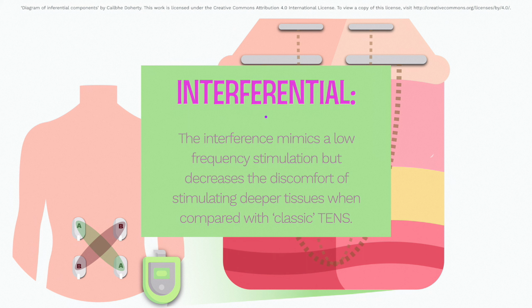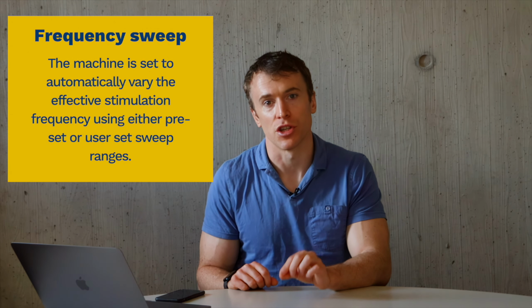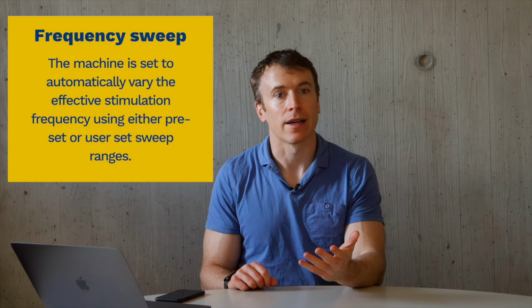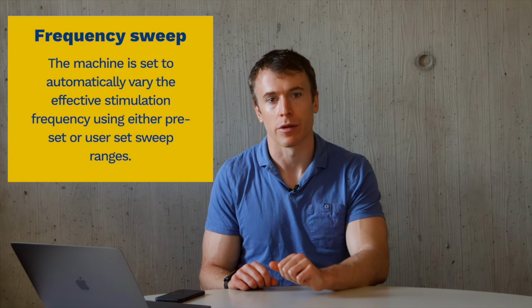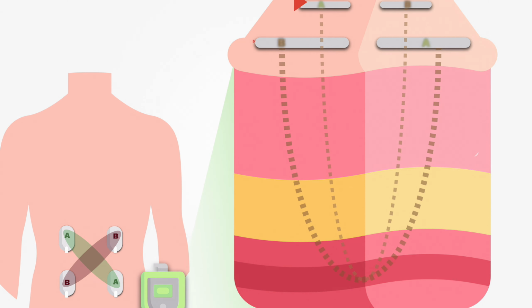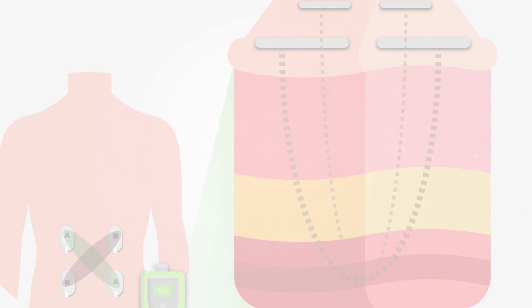Because nerves will gradually accommodate to a constant signal, what's known as a frequency sweep is also often used. The principle of the sweep is that the machine is set to automatically vary the effective stimulation frequency using either preset or user-set sweep ranges. Basically, the input frequencies, and therefore the beat frequency, are varied slightly within a suitable window so that the analgesic effect doesn't decrease over time.